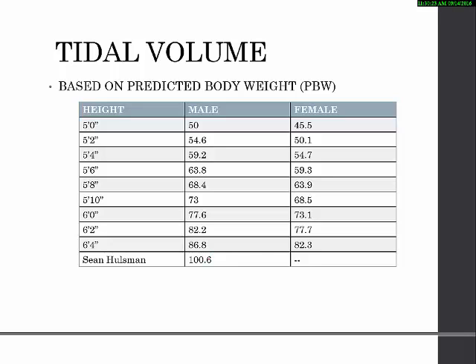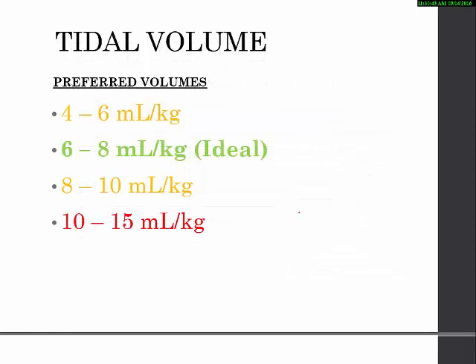So with a height chart, obviously I'm always on the outlying extreme here, but this is my predicted body weight, which actually is a little bit low because I need to hit the gym again. The predicted body weight for me would be 100.6 kilograms, and these are other body weights. This is just how the respiratory people would determine the approximate tidal volume, how much per breath.